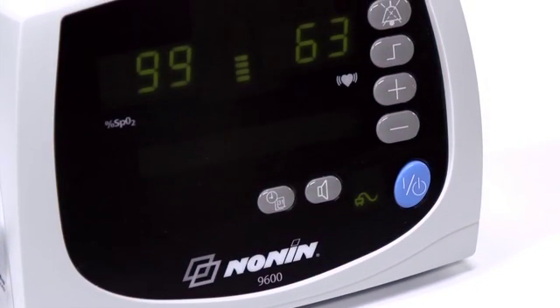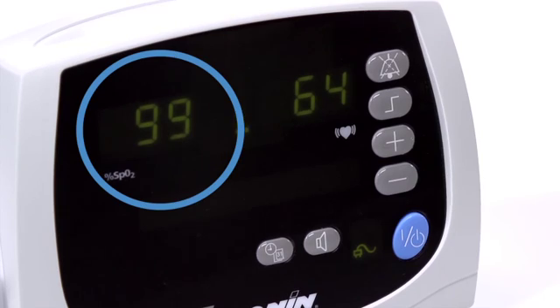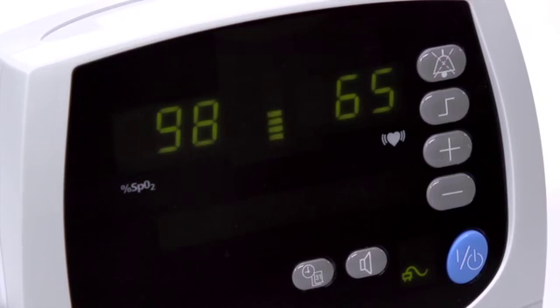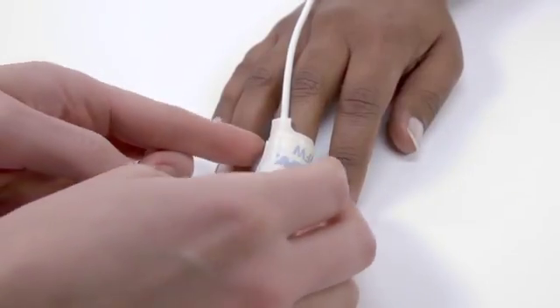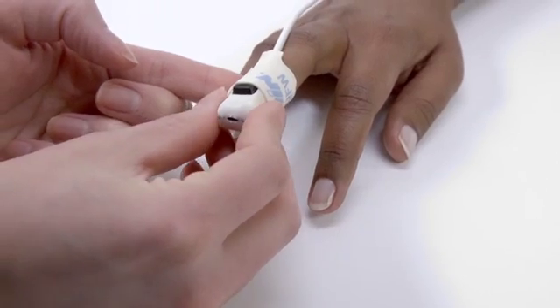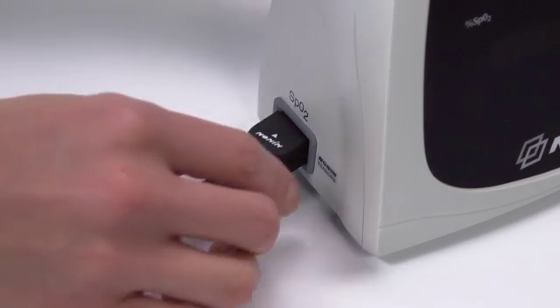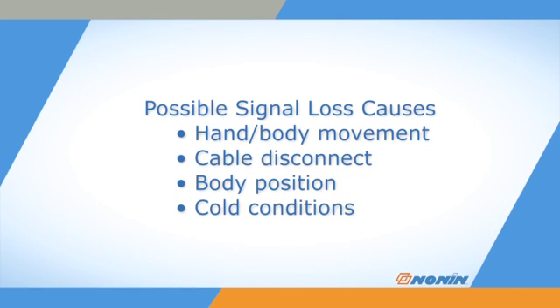The oximeter will start displaying and recording SpO2 and pulse as soon as the sensor is placed on the patient. The SpO2 level is shown on the left side and the pulse rate on the right side. The pulse strength signal bar in the center indicates the signal quality. Green bars indicate a strong reading, amber indicates a marginal reading, and red indicates a low reading. It's a good idea to check pulse signal quality at start-up and adjust the sensor for a stronger reading if necessary. Signal loss from the sensor is possible with hand or body movement or disconnection of the cable. Check and correct the position of the sensor if it has moved and recheck the sensor connection to the oximeter. Signal can also be reduced by body position or cold conditions, which may reduce blood flow. Relax and warm the hand to restore stronger blood flow.